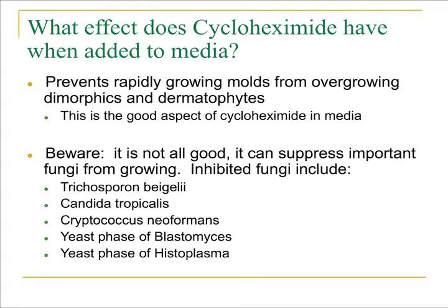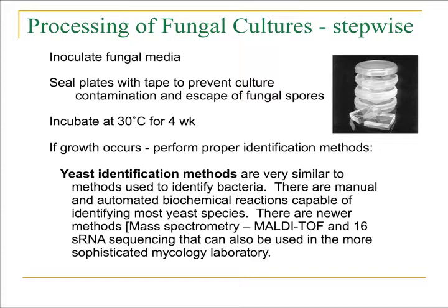On the next slide, we talk about the processing of fungal cultures. The stepwise processing includes, of course, the first step being to inoculate the fungal media that you're choosing to use on that patient specimen. The second step would be you need to seal the plates with tape or some kind of a shrink seal to prevent culture contamination and escape of fungal spores from the growing culture. All cultures are then put in an incubator at 30 degrees centigrade for 4 weeks.